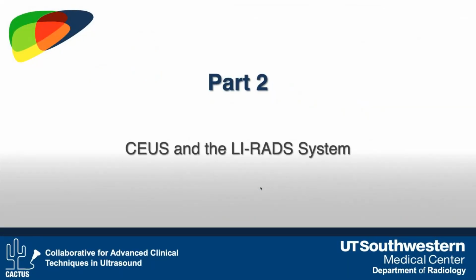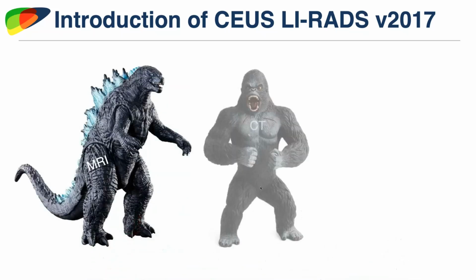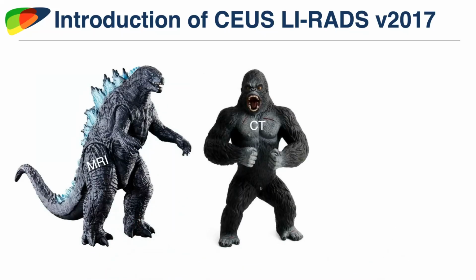All right, so part 2, how does contrast ultrasound fit into the LI-RADS system? So this is a diagram I borrowed from Dr. Marks, who gave a fantastic talk, I believe last week, about the recent past of LI-RADS and where contrast ultrasound came in. And as you can see, it was just a couple of years ago. And I can imagine a lot of advocates for MRI and CT were sitting around going, well, why do we need another modality for diagnosing HCC? I mean, we're the big guns. We do a fantastic job at this already. Why do we need another player?